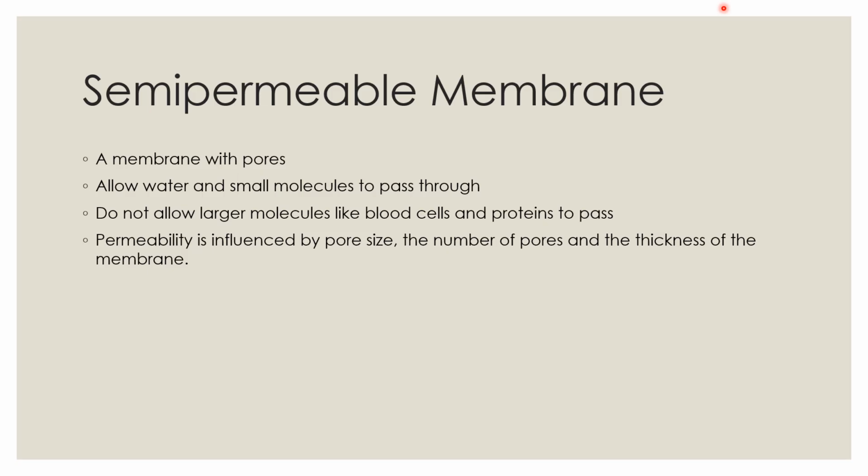Permeability of the membrane is influenced by the pore size, number of pores and the thickness of the membrane. Solutes pass through the membrane according to solute size. High flux membranes that have a larger pore size increase the rate of clearance by allowing larger molecules to pass through the membrane and by allowing more ultrafiltrate flow. Permeability of solute decreases as the molecular size increases. The surface area of the membrane determines the available area for diffusion and ultrafiltration.